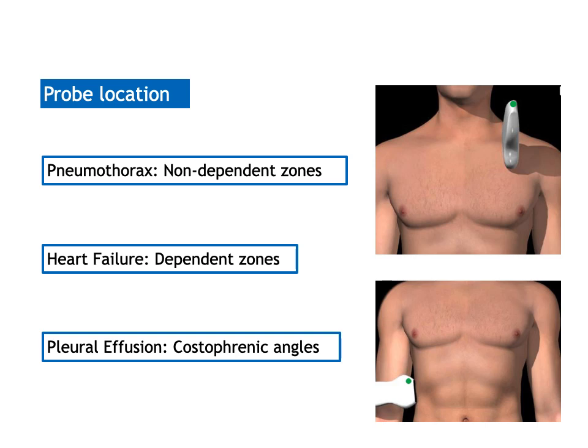And when we put the probe in this location, we have the diaphragm as our anatomical landmark, and we would expect to see below the diaphragm on the right side the liver, and below the diaphragm on the left side the spleen, in this plane.